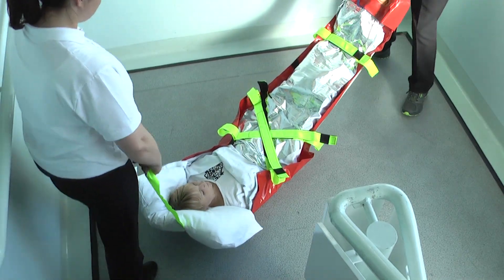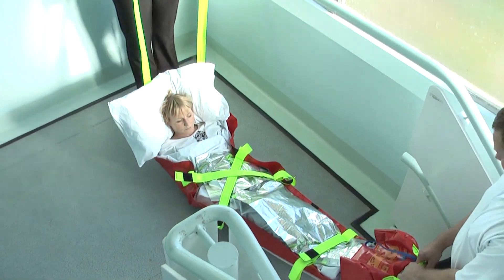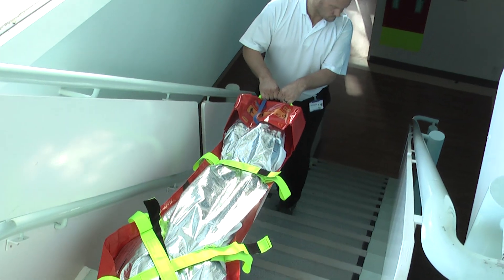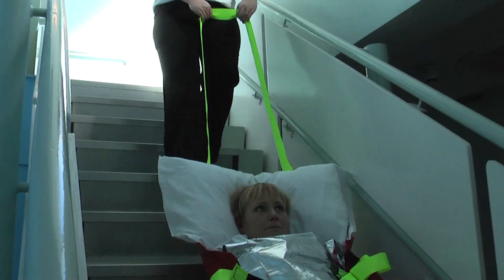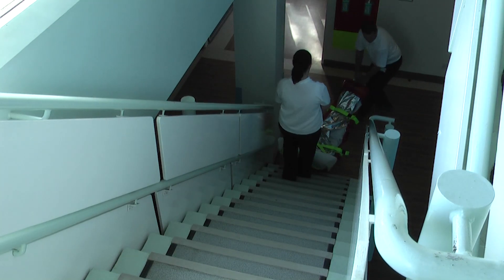When reaching the half landing, it is important to steer a wide course so you do not encounter problems with the central pillar of the staircase. If needed, the webbing loops located along each side of the mat can be used to help position the ALBAC mat between stair runs. The speed of descent is controlled by the operator at the head end whilst communicating closely with the foot end operator.